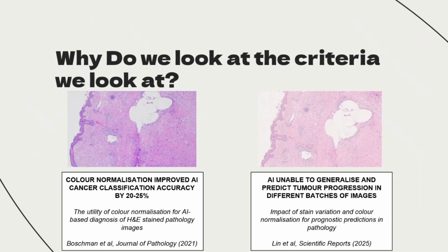The image on the left is what the slide looked like down the microscope. The image on the right is the digital image that was uploaded to us. And you can see there, the two are not the same. And it's just really important that the coloration should be the same. And again, this is just something that we consider. 27% of our submissions so far have had image colours that didn't match the glass slide.